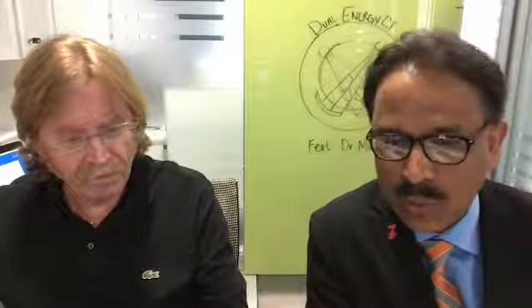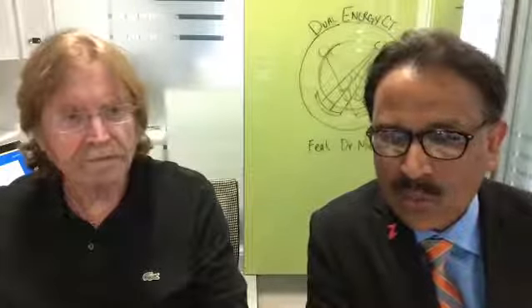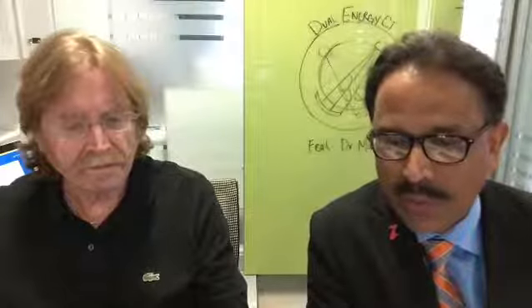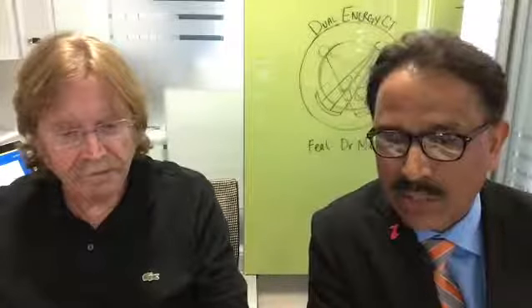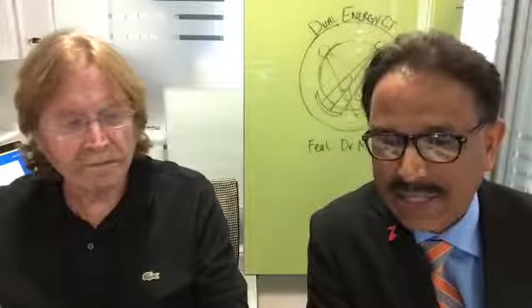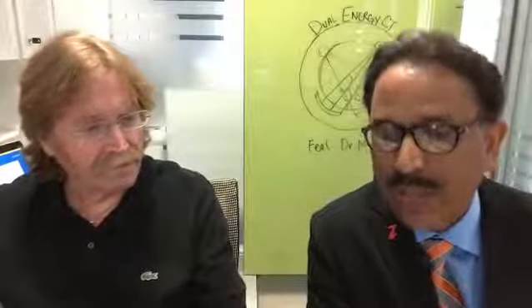They have these dual source CTs, which have two X-ray tubes put inside the gantry. And that's one of the easiest ways because this allows technologists or radiographers to set the protocol to operate the X-ray tubes at two different tube voltages. Meaning we are already getting two different energy X-rays passing through the body, and we can combine the data and create dual energy data sets, which can be displayed at multiple different energy levels. That's one methodology.